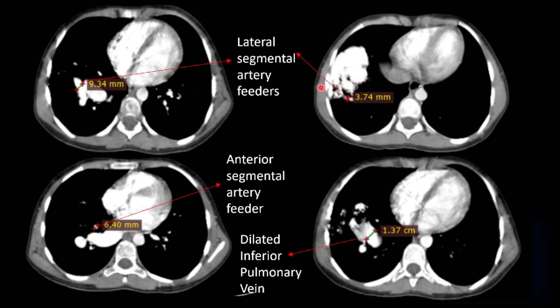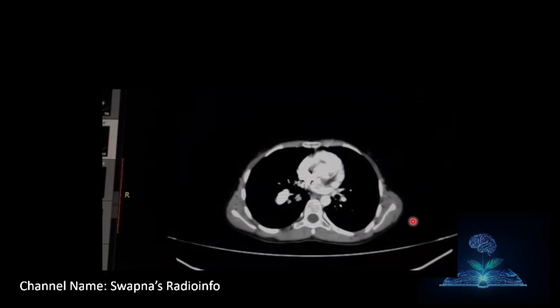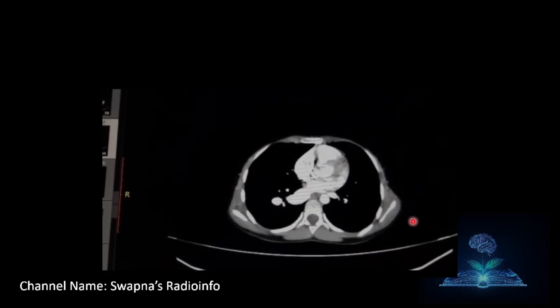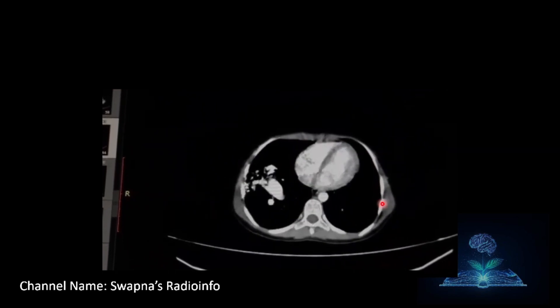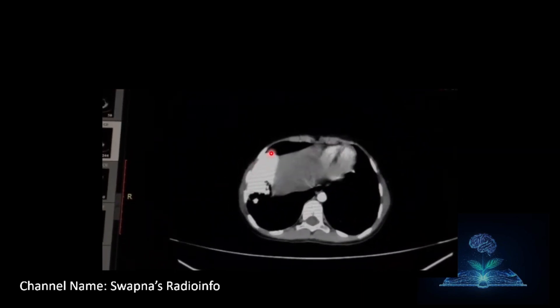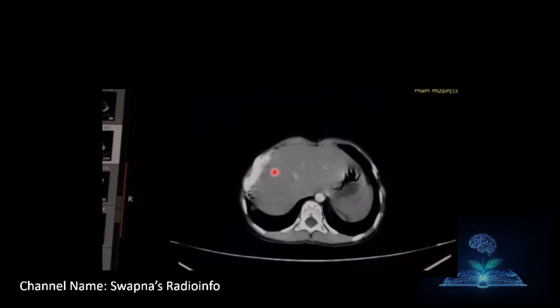The lateral segmental artery measures 9.3 mm; another arterial feeder measures 3.7 mm, and the anterior segmental arterial feeder measures 6.4 mm. There is a dilated tortuous inferior pulmonary vein measuring approximately 13 mm. The CT pulmonary angiogram video clearly shows this intensely enhancing vascular lesion in a subpleural location in the right lower lobe.